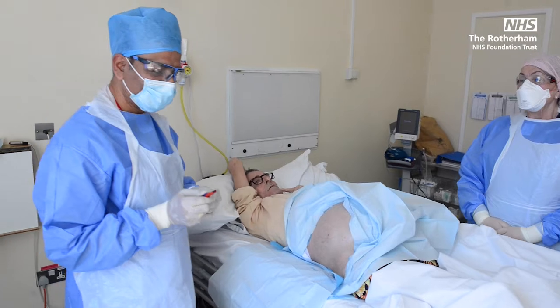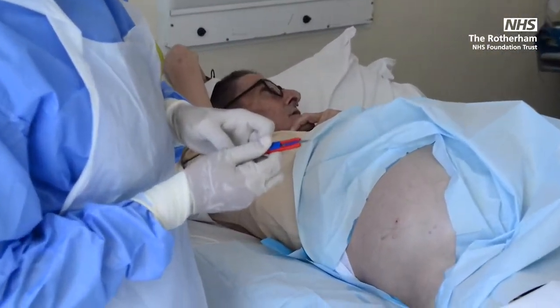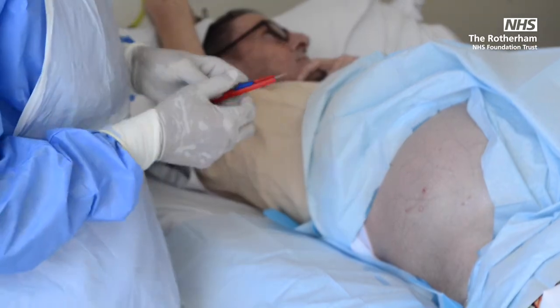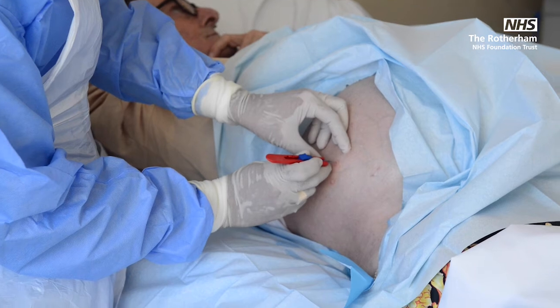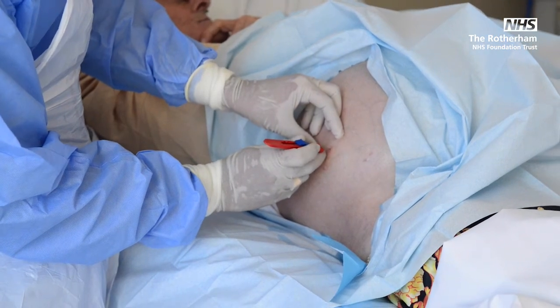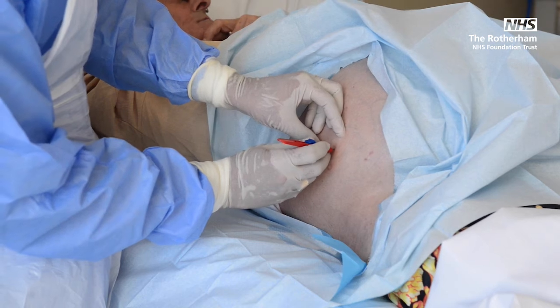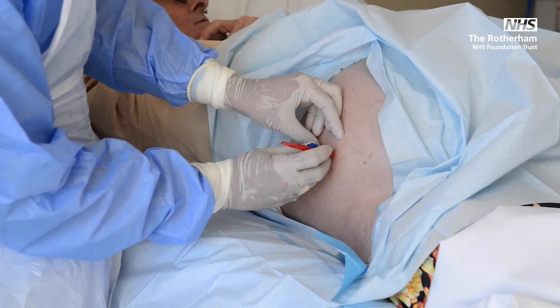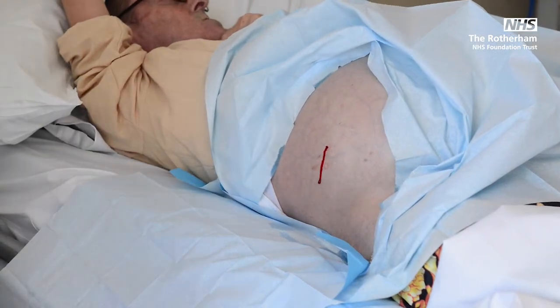Next, take the scalpel and protrude it so that it's around 1 to 1.5 centimeters, and go perpendicular to where you injected. So can you feel it now? No. Is it like a sharp or pressure? Pressure, yeah. Okay, so I just made the incision.